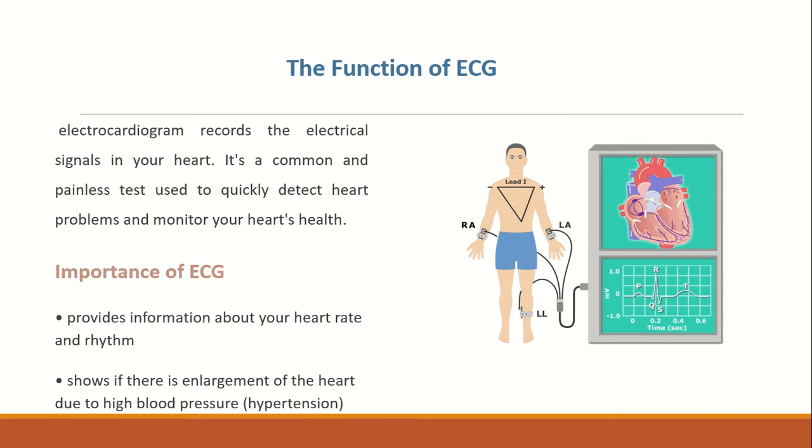I will be presenting an ECG. The function of an ECG, electrocardiograph, is to record the electrical signals in your heart. It is a common and painless test used to quickly detect heart problems and monitor your health. The importance of the ECG is that it provides information about your heart rate and rhythm, and it shows if there is any enlargement of the heart due to high blood pressure.